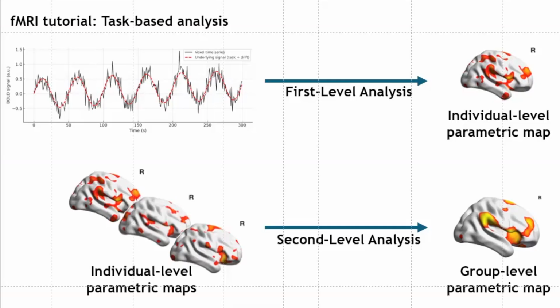To do this, you have to normalize all the subjects in standard space. Yeah, but it's what we did. It's a statistical map at the second level. So it's not overlapping, but each subject will be a data point. Here, it's just one image per contrast, so it's one image per subject.